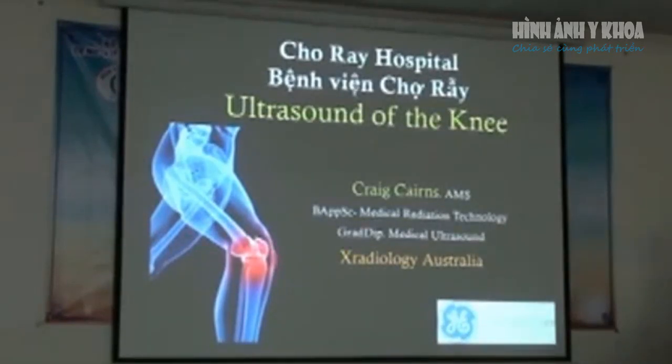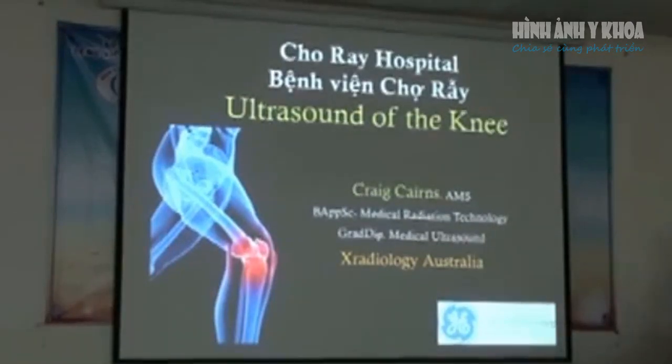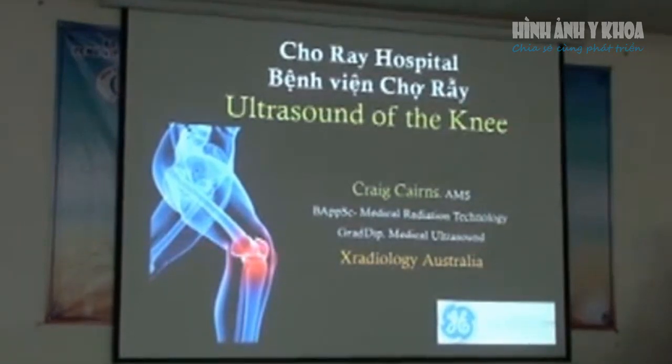Okay, welcome back after lunch. Chào mừng các bạn quay lại sau bữa ăn trưa. So this afternoon session, we're just going to talk about ultrasound of the knee and what we can expect to see in that area. Mình sẽ đề cập đến những vấn đề, những cấu trúc nào mà mình mong đợi trên siêu âm khớp gối này.